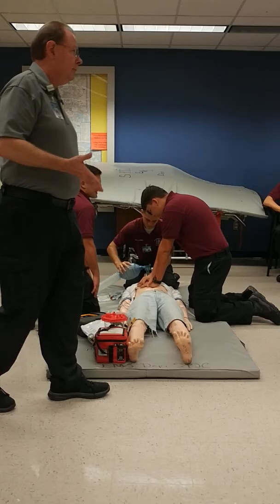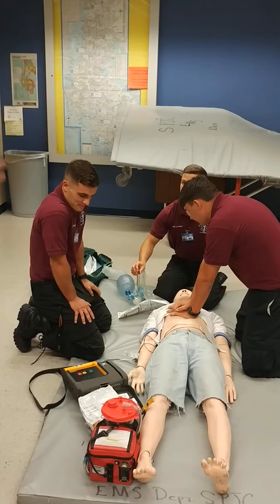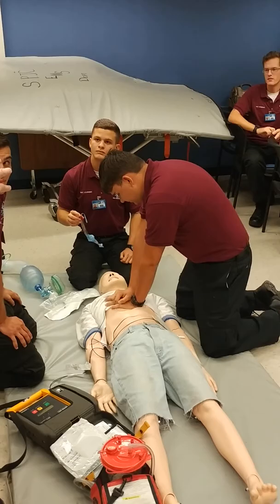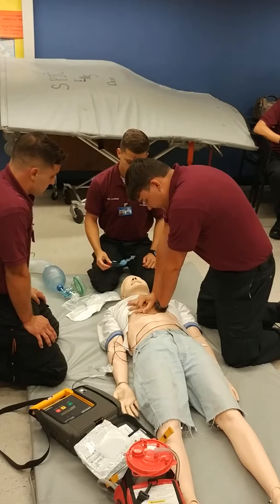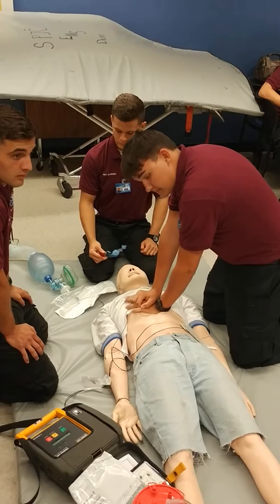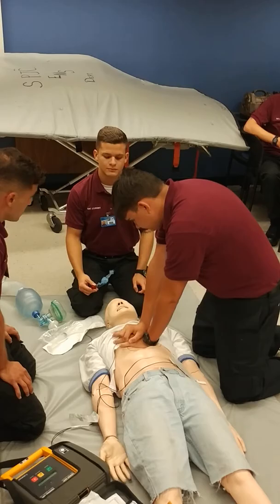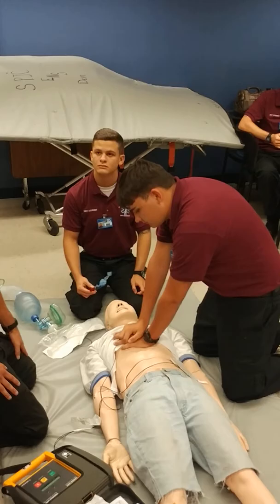During this rotation, we wait about a minute then place the King. We want to give ourselves at least one minute to place, confirm, and secure. The person who preps the King hands it to the person at the head, who actually inserts it. The AED person then confirms placement by listening with a stethoscope. Once placement is confirmed, the head person continues to bag and the AED person secures the tube.